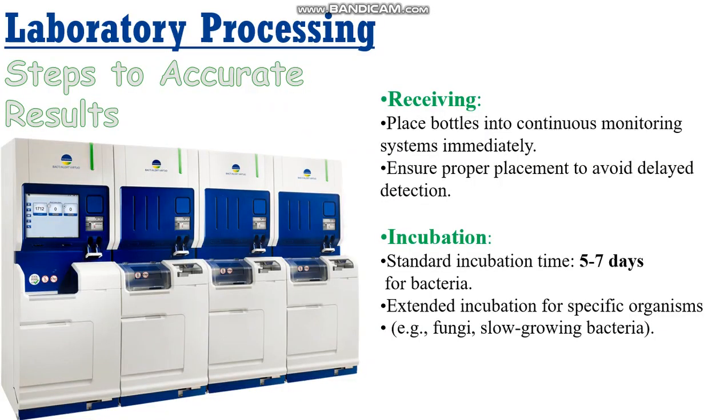Once blood culture bottles reach the lab, processing begins to ensure timely and accurate results. Bottles should be loaded into a continuous monitoring system immediately upon arrival. This ensures that any microbial growth is detected as quickly as possible.